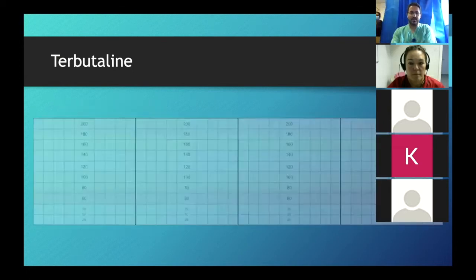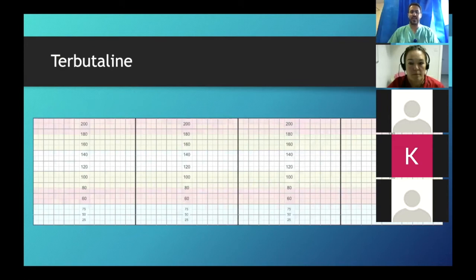Let's imagine that we have a baby that is running into distress. So we started off with a normal baseline. This baby's baseline is about 130. Okay, it's now getting more distressed. So adrenaline starts to come out. And with the adrenaline coming out, the baseline goes up. Yes? Guys, I need some feedback. Yes. Sorry. Yeah.